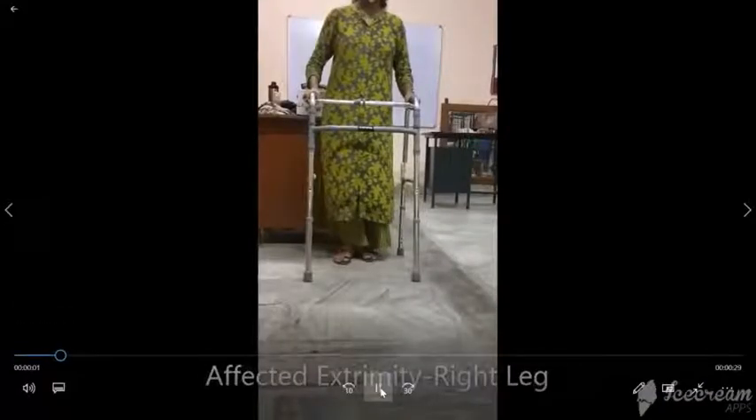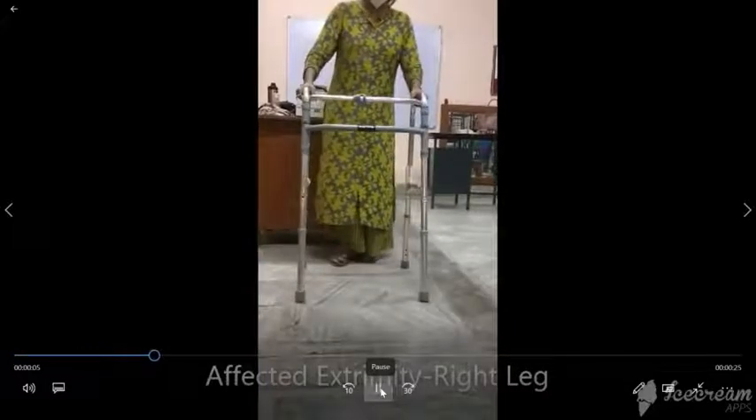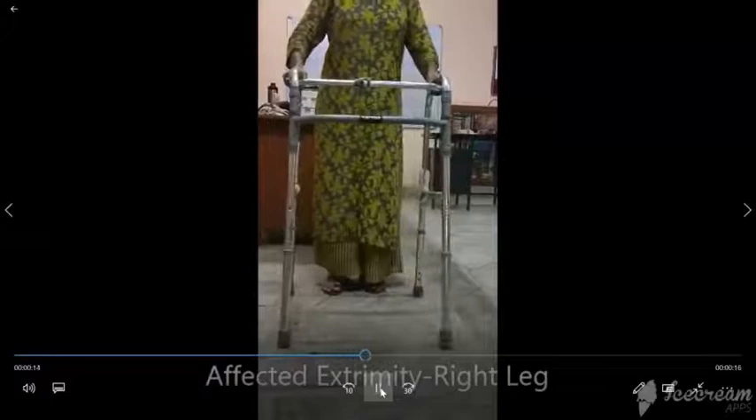For walking, hold the grip of the walker with both hands. Bring the walker just enough to take one step. Now step forward with your affected leg, and push on the walker as needed for support.